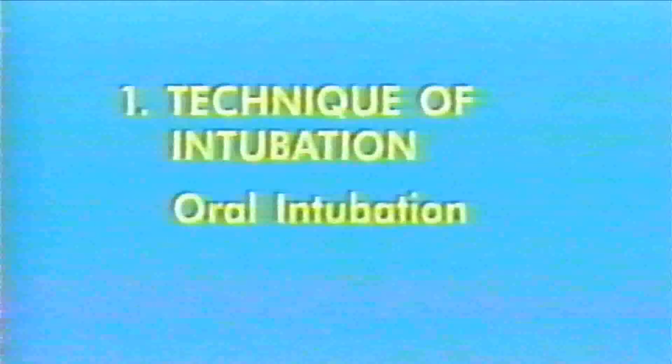First, technique of intubation. We describe the procedure which is applied to intubation during induction of anesthesia. The technique for other circumstances would require some modification of this. First, we'll proceed with oral intubation, followed by nasal intubation. Oral intubation. Equipment should be checked before intubation is attempted.